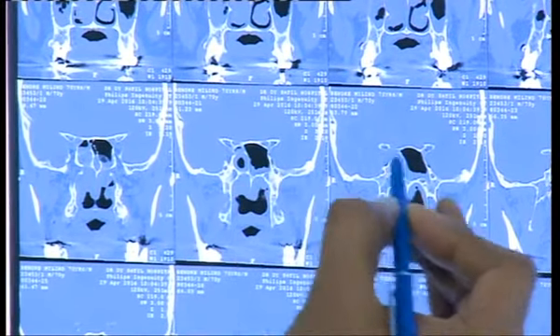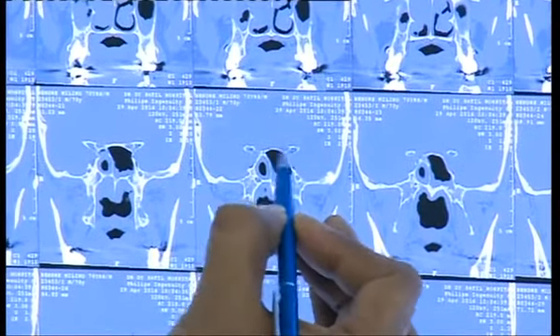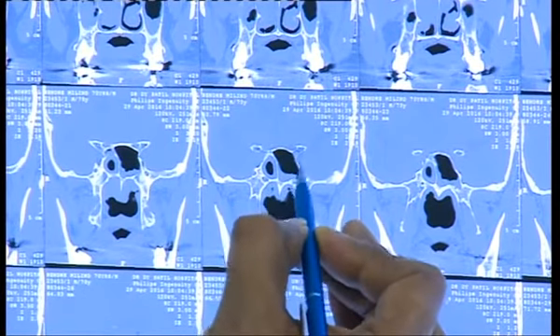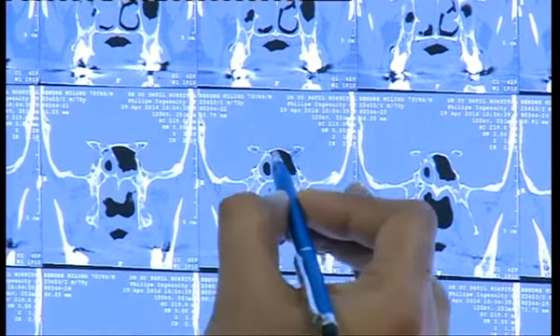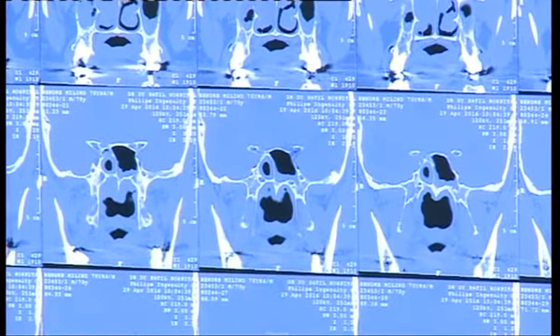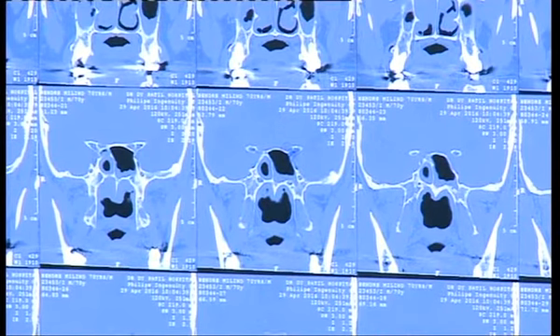So in this picture, you see there are two impressions superolaterally. Can you see this? Just medial to the anterior clinoid processes, that belongs to the optic nerve on both sides, and two impressions laterally. And in between is the clinoid process. Sometimes it is over-pneumatized and you may have a bigger opticocarotid recess. So this is the impression for the optic nerve and carotid artery, and what you need to see surgically is whether they are dehiscent, prolapsing in the sphenoid wall, or any kind of anatomical abnormality in this region that you need to be careful about during surgery.